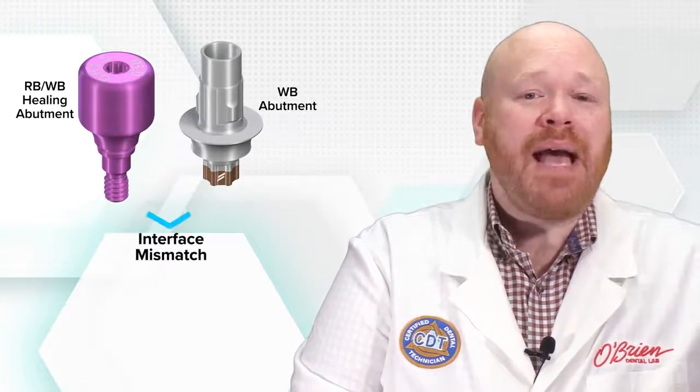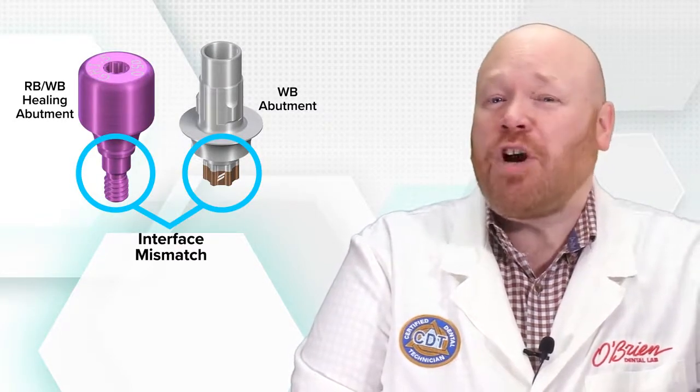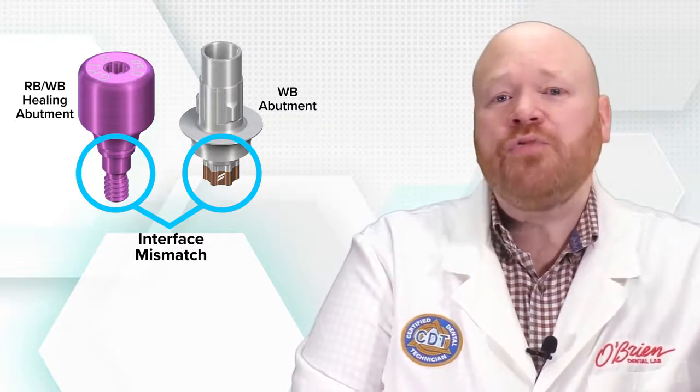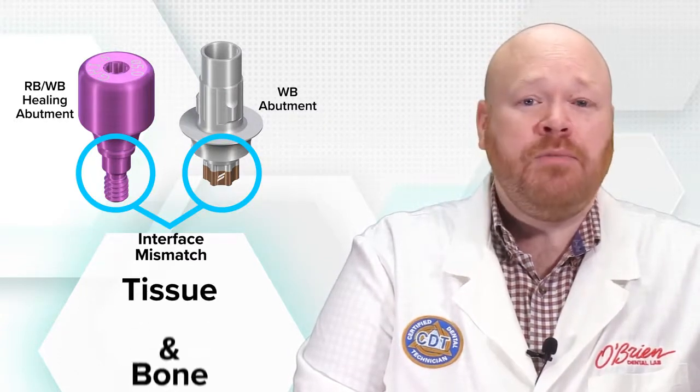The interface of the WB abutment didn't match the interface of the 5mm healing abutment, which actually is an RBWB. And there are two reasons why that mismatch could prevent the abutment from seating: tissue and bone.